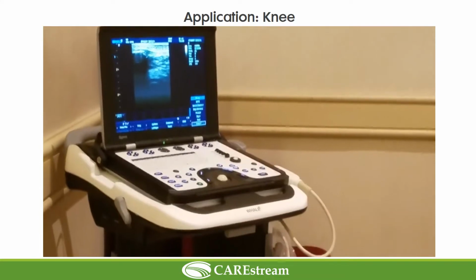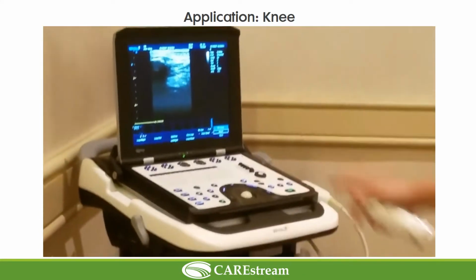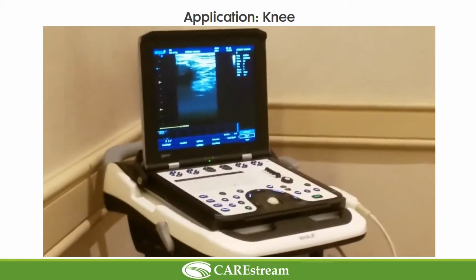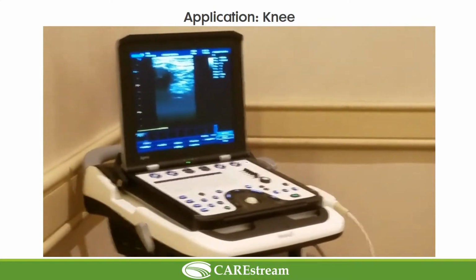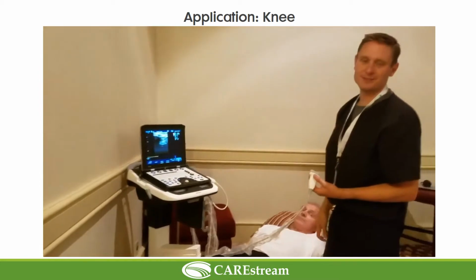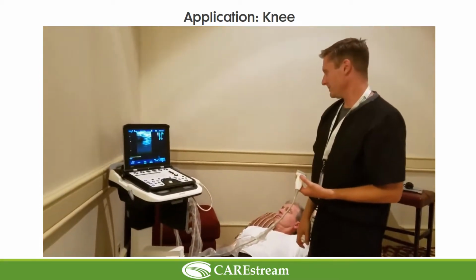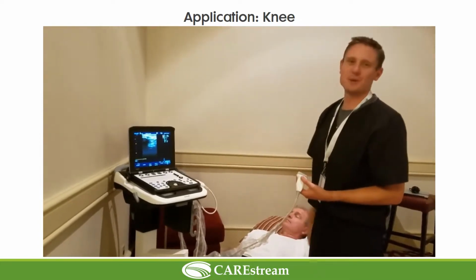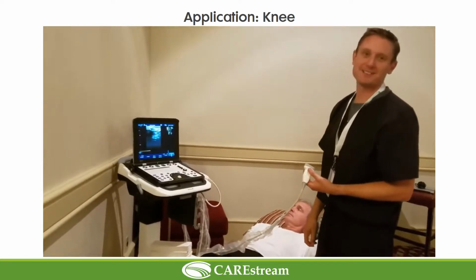Now why is that important? You see the black sitting on top of the tibial condyle here? That's the cartilage of the condyle. That's the cartilage of the knee. So if you have a doctor that actually wants to look at cartilage, that's your view right there. Most docs are concerned about how much cartilage someone has on their femoral condyle. I think I said tibial. On their femoral condyle, there's a view right there of how much cartilage someone has.